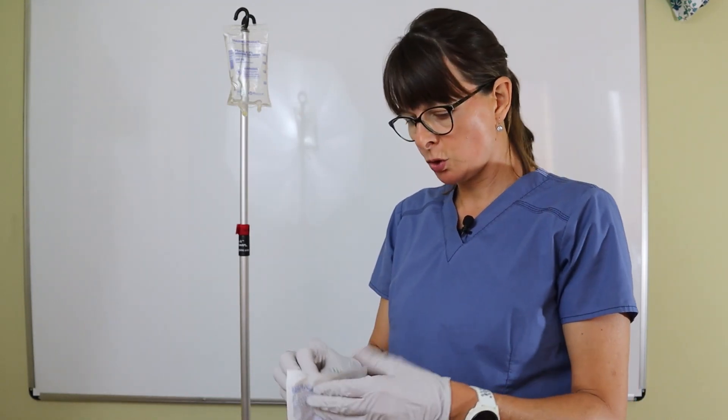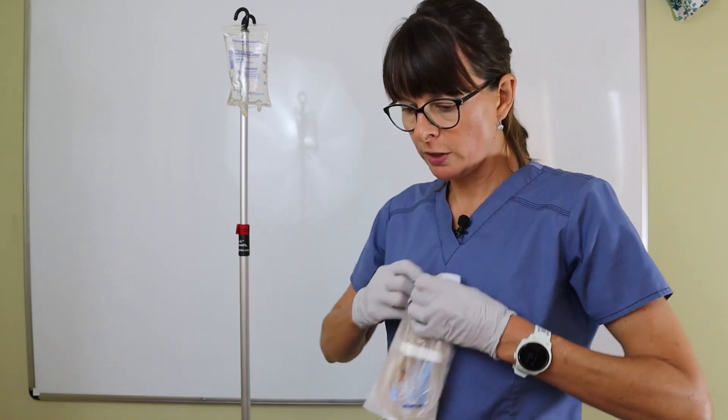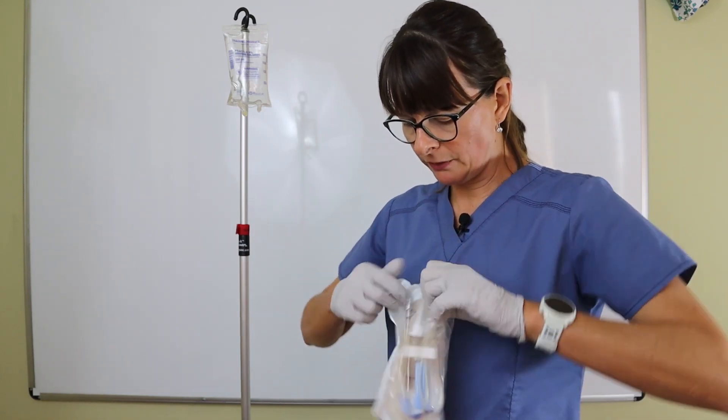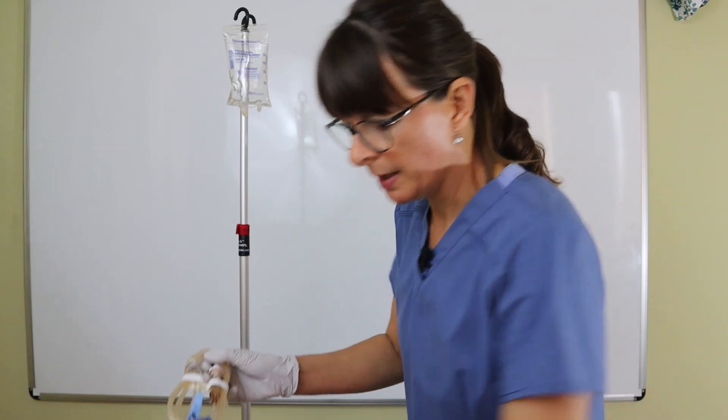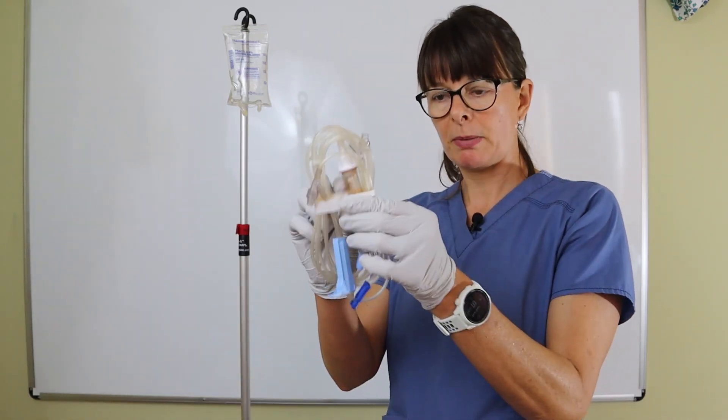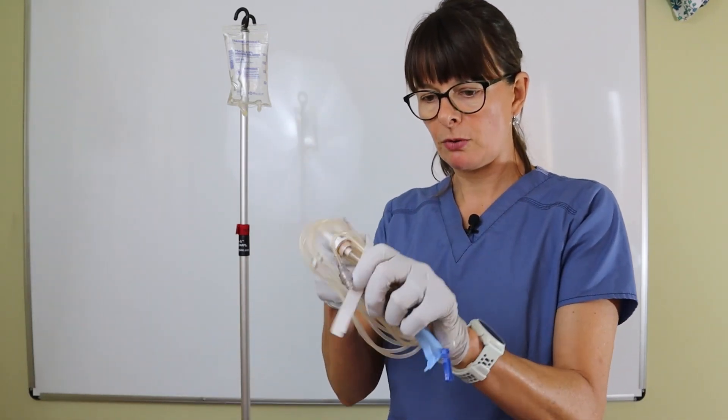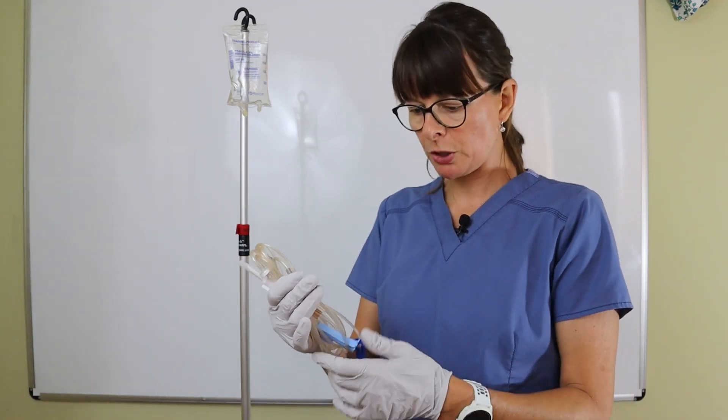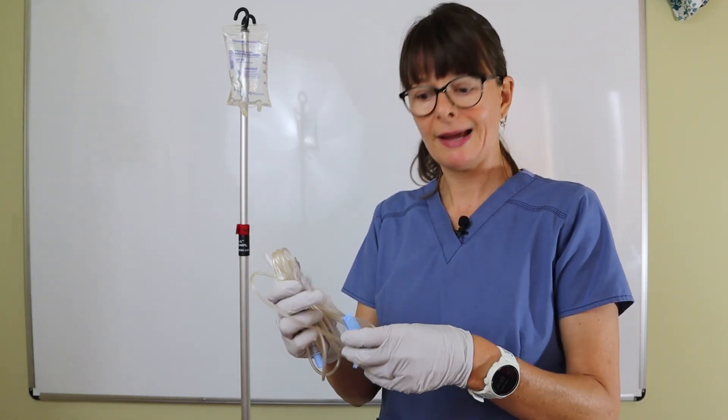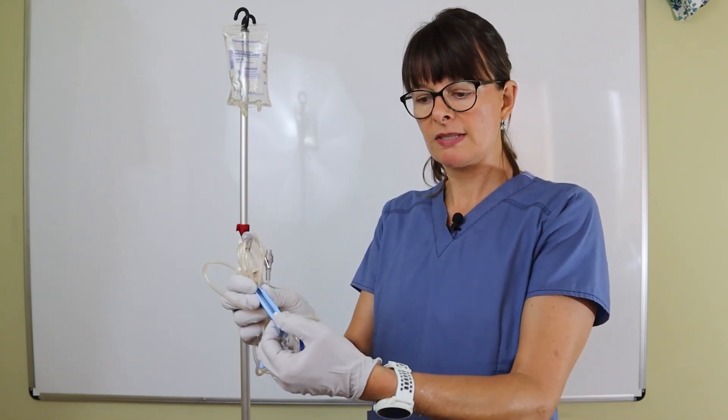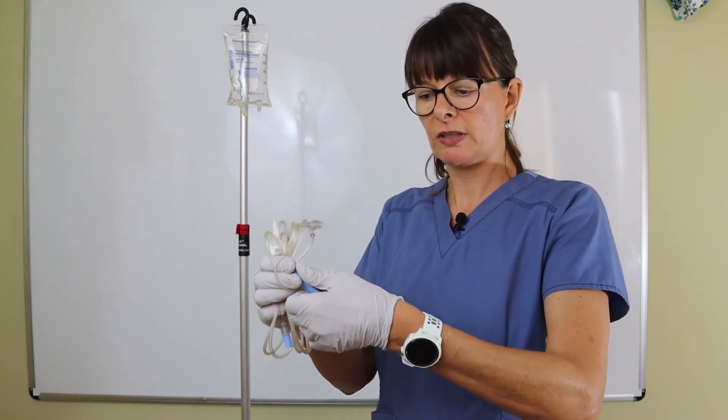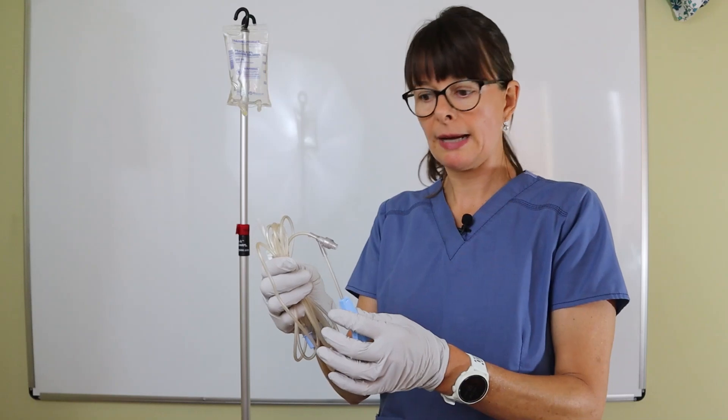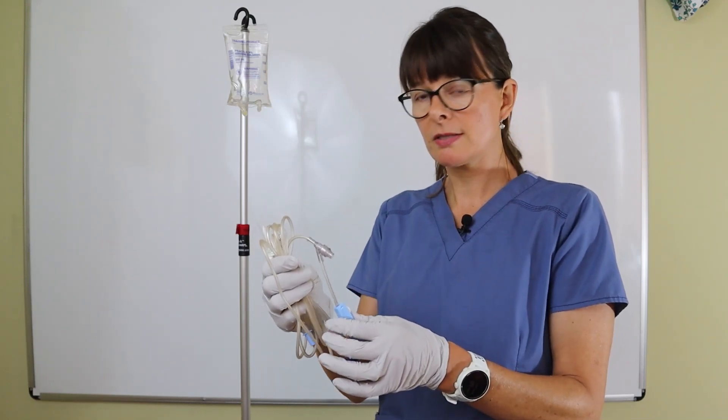I take my IV tubing out of the wrapper—it's usually nicely set up like this. I take off any paper wrap that holds it together. A very important first step is to close the clamp right here. You can see it's kind of loose; if I switch it the other way, it closes the clamp.